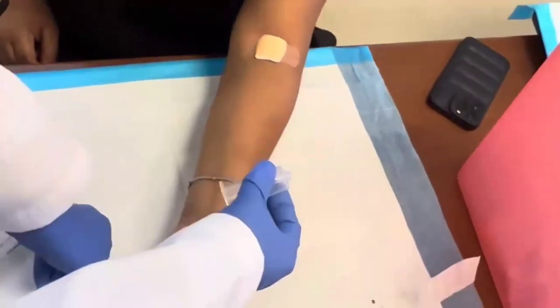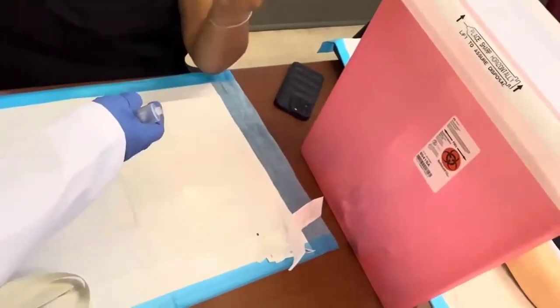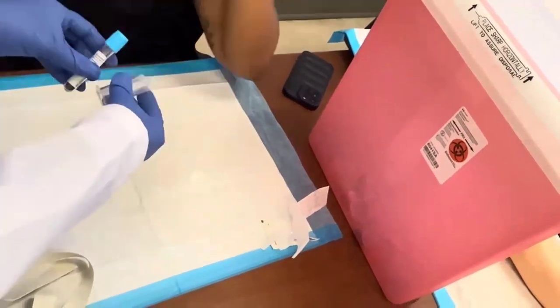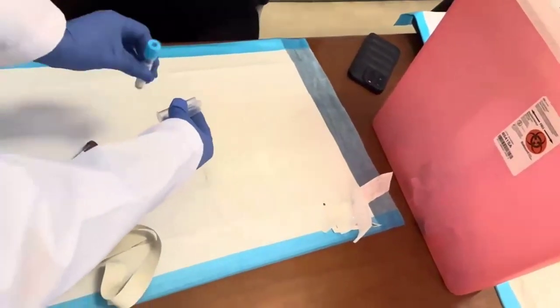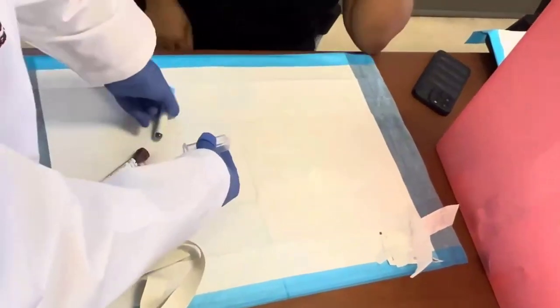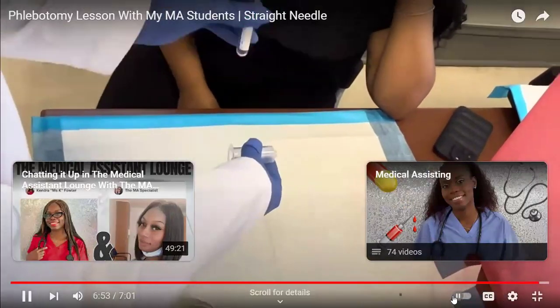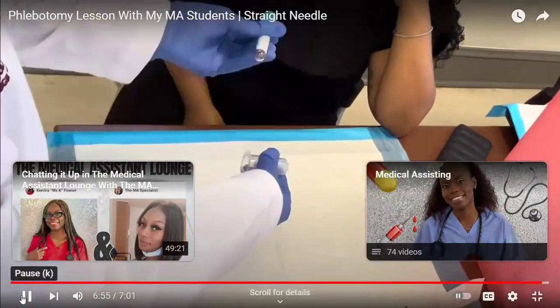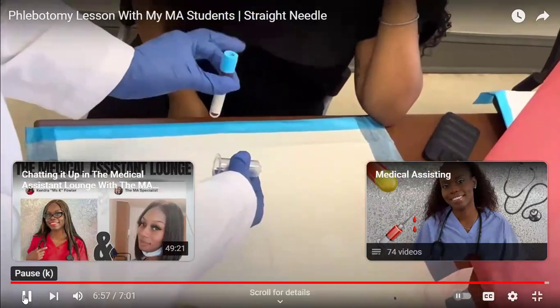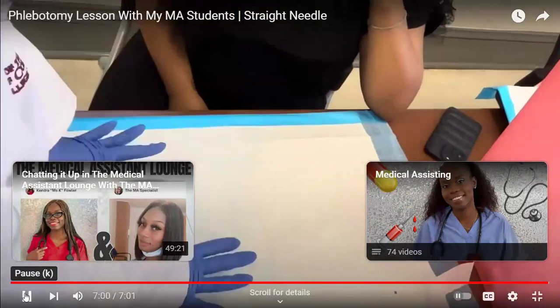One thing too I want to mention, remember the tubes have additives in it, so we have to invert it. So normally when I'm drawing blood, as I am sitting my tube down, I normally just invert it a few times as I sit it down, and then I'll go back and invert it 8 to 10 times or 5 times, depending on the tube, because each tube has a certain number of times it needs to be inverted. Alrighty guys, so that's that.